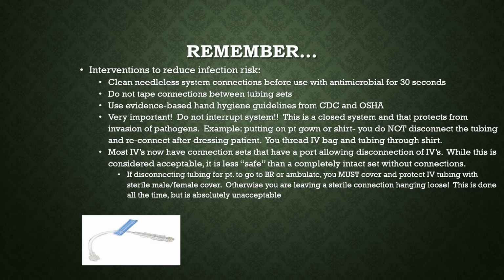Use evidence-based hand hygiene, very important. Also very important, and I know I'm in the minority here, but when I was practicing, we never unhooked a patient's IV, ever. And now they do it all the time. If a patient wants to go to the bathroom and they've got a pump, they just disconnect it. They go to the bathroom, and I'm shocked sometimes that they're doing that, because IVs are supposed to be a non-disconnecting system. Every time you disconnect tubing, you run the risk of introducing bacteria. This is supposed to be a closed system.